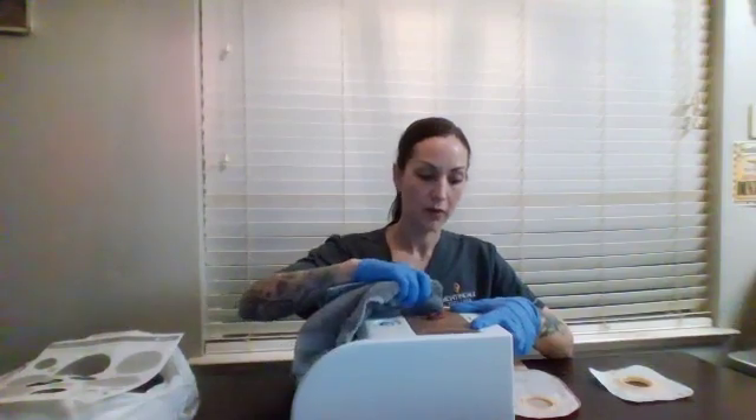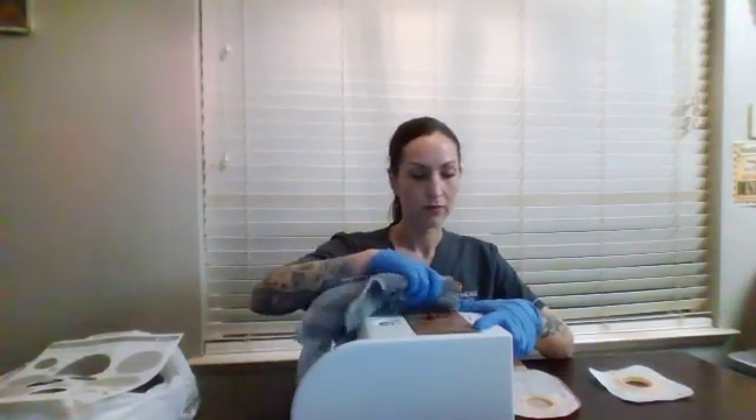Now we're going to dry the skin and the stoma completely by using another washcloth, working in the same fashion — inside out. Then you can toss this into the garbage.